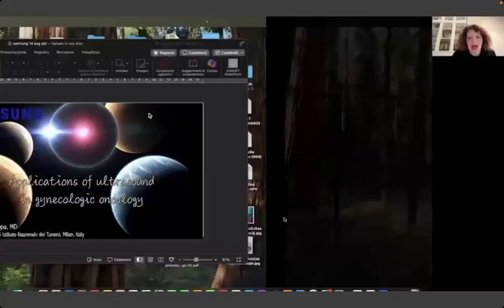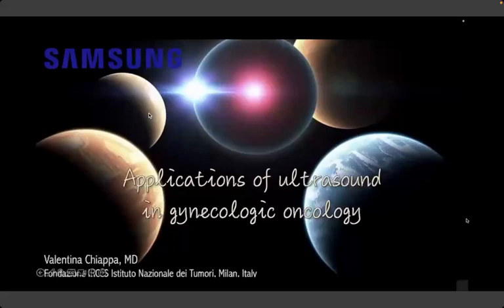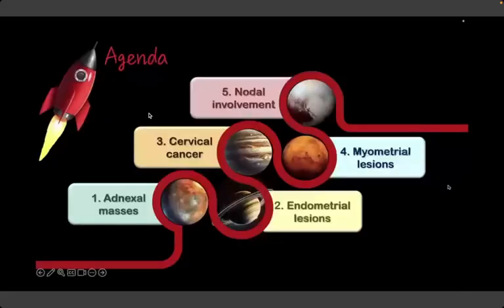Good afternoon, everyone. It is an honor for me to participate in this webinar, and I really thank Samsung for the invitation. Together, we will explore the possible application of ultrasound in gynecological oncology. In particular, we will take a journey through different gynecological conditions: adnexal masses, endometrial lesions, cervical cancer, myometrial pathologies, lymph node assessment. And for each topic, we will see how ultrasound could be useful.